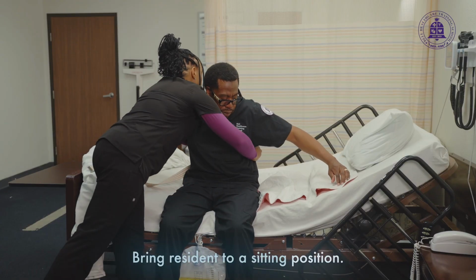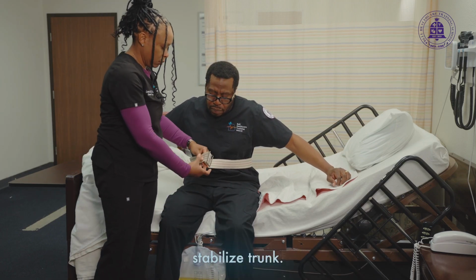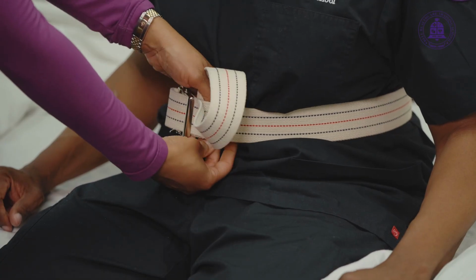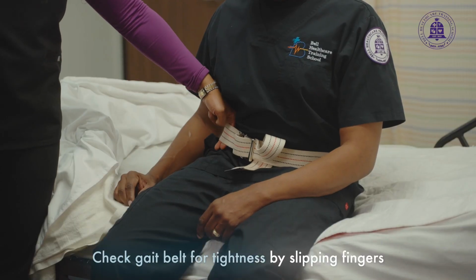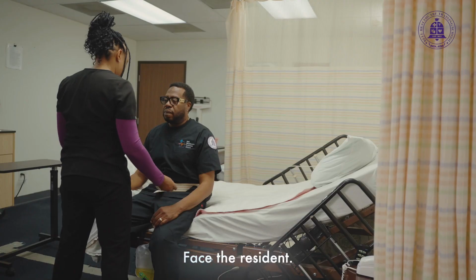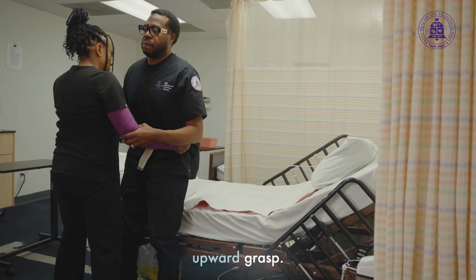Bring resident to a sitting position. Place gait belt around resident's waist to stabilize trunk. Tighten gait belt. Check gait belt for tightness by slipping fingers between gait belt and resident. Face the resident. Grasp gait belt on both sides with an upward grasp.